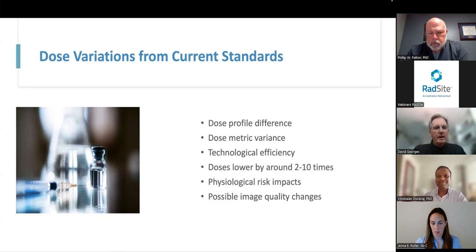But we would love to know more from you on the efficiency of the CurveBeam CT scanners used for breast scanning. Sure. In the case of dedicated cone beam breast CT, we have to be mindful that we are looking at a comparison not to whole body CT scanners as much as to mammographic dose. That gives us the parameter where we are required to stay within the same dose level that is currently accepted in mammography. The difference in the two modalities is very simple. We are using conventional cone beam scanning, but with a mammographic X-ray tube and a high resolution mammographic detector. We are not compressing the breast, but we are delivering a 7-second rotation around the breast that is pendulously inserted into the aperture of the cone beam table.